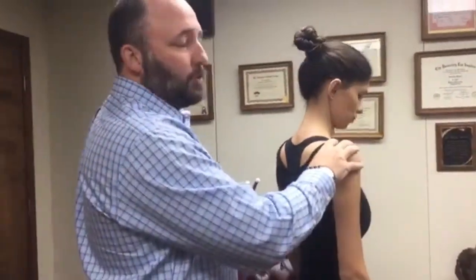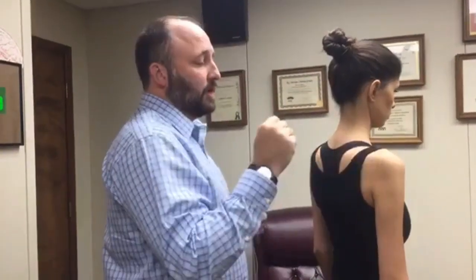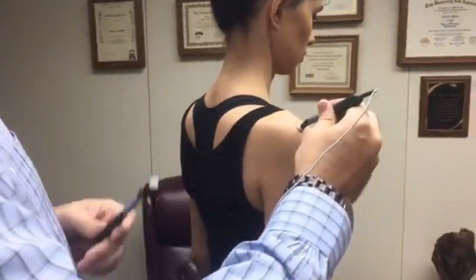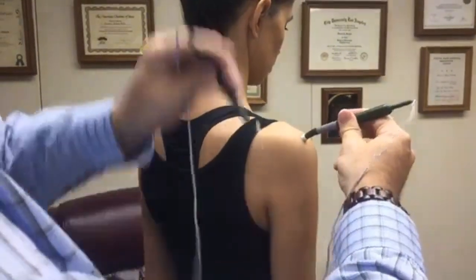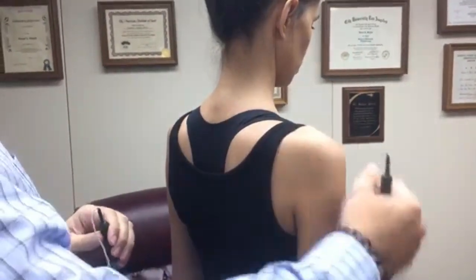So that's our two-minute protocol. We would ask Rachel what her pain was on a 0-to-10 scale when we started — let's say hypothetically it was a seven. After the two-minute protocol, she might be down to a three. Always check range of motion; maybe she has more range of motion now. If she still has residual pain — maybe a three or four — I'd have her point to the worst area. We put one probe right there, stationary, and move the other one around ten seconds at a time, going right through that worst spot of pain.